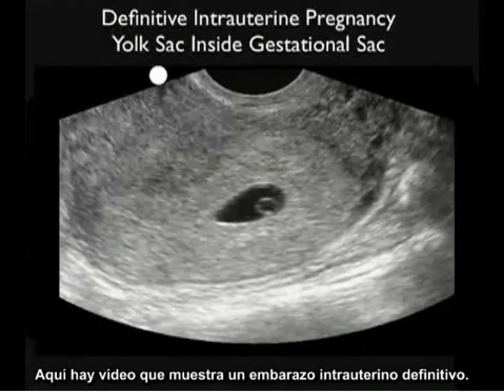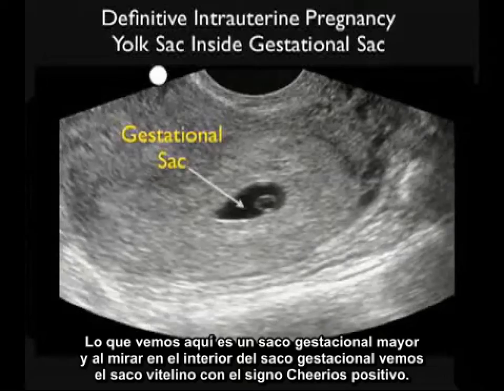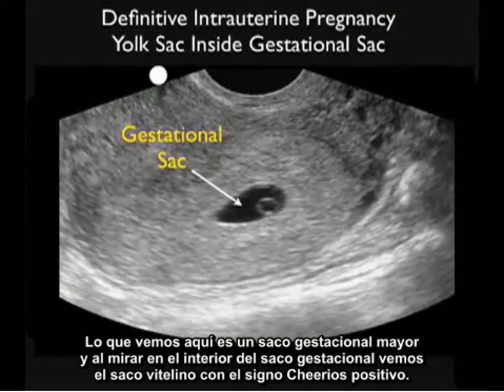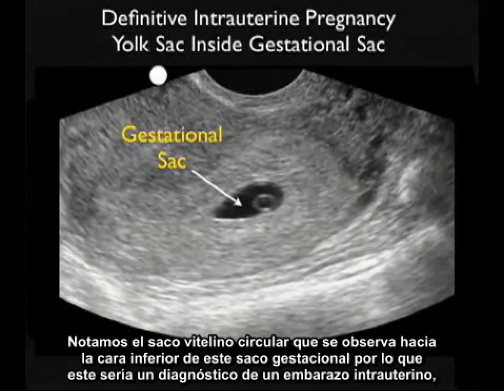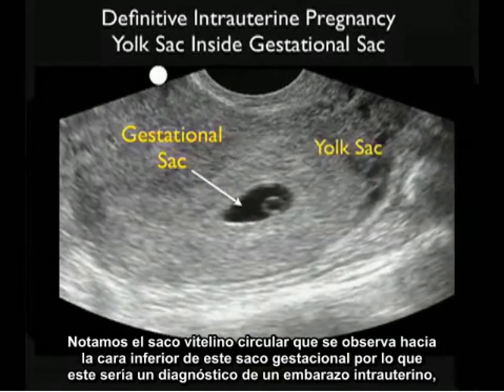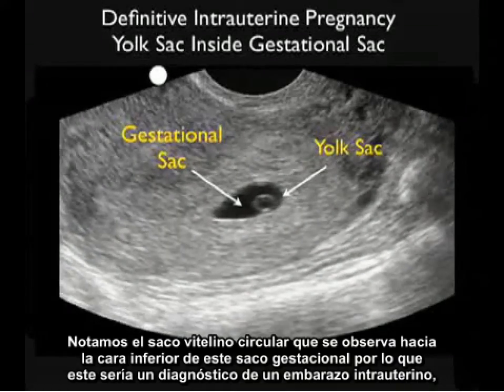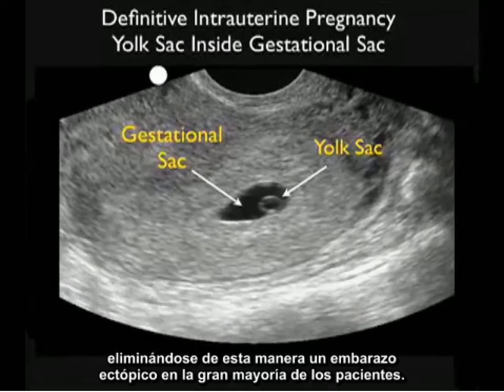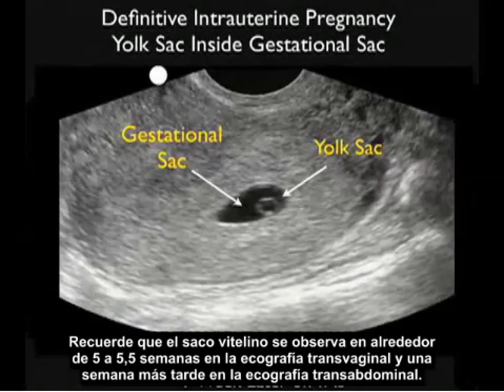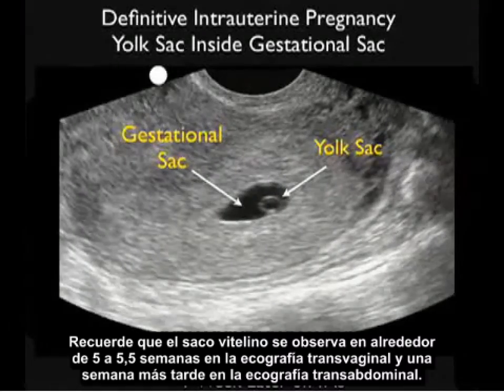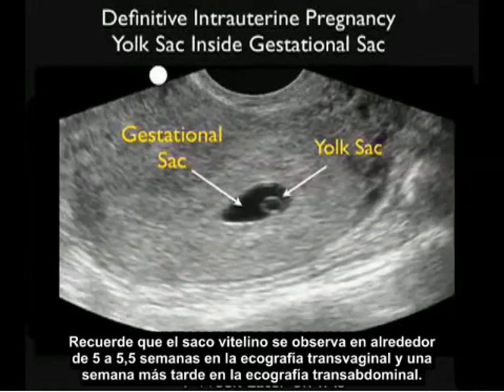Here's a video clip showing a definitive intrauterine pregnancy. We see a larger gestational sac, and inside we see the positive yolk sac or cheerio sign. Notice the circular yolk sac is seen towards the inferior aspect of the gestational sac. This is diagnostic of an intrauterine pregnancy, effectively ruling out ectopic pregnancy in the vast majority of patients. Remember, the yolk sac is seen at about 5 to 5.5 weeks on transvaginal sonography and about a week later on transabdominal sonography.